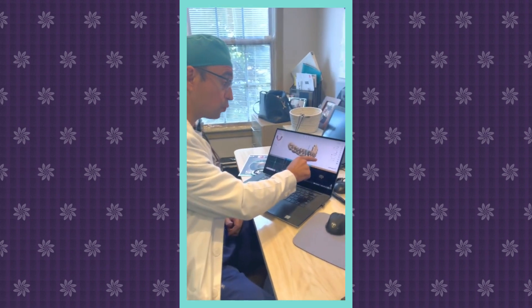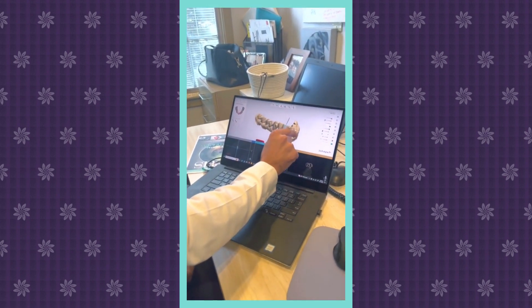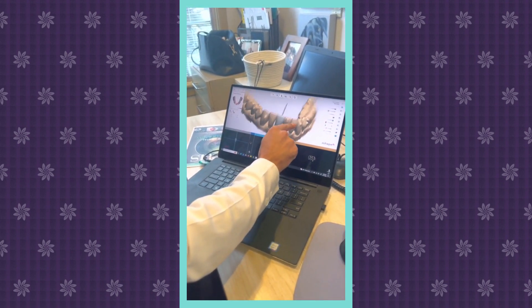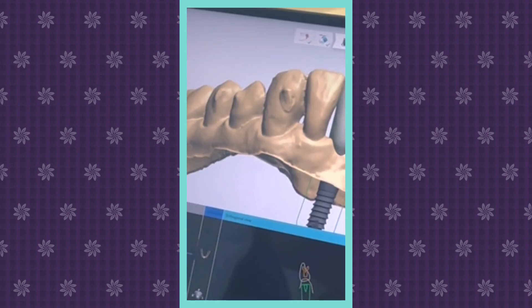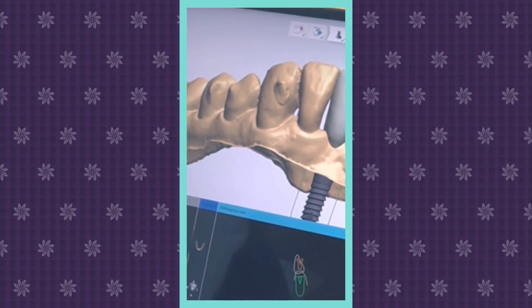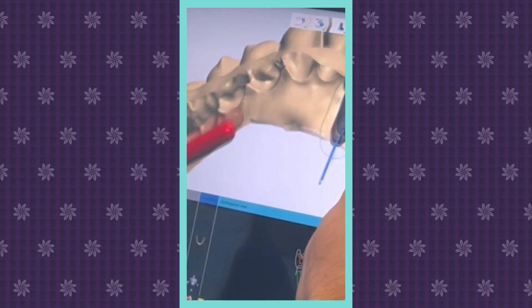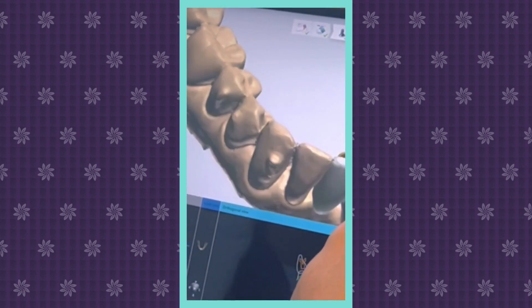So what we use here, this is a software where we start with the end in mind. In other words, this person is missing this wide tooth, we're going to place the ideal wide tooth in the place of the missing tooth right here. Once we have that, then we're going to plan an implant that appropriately supports that tooth in the proper angulation.